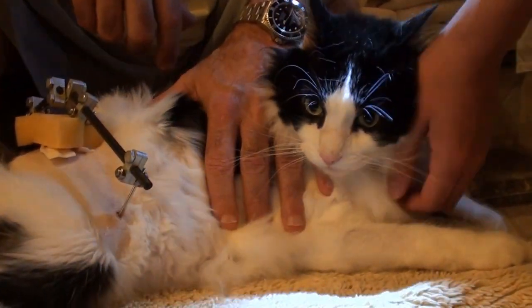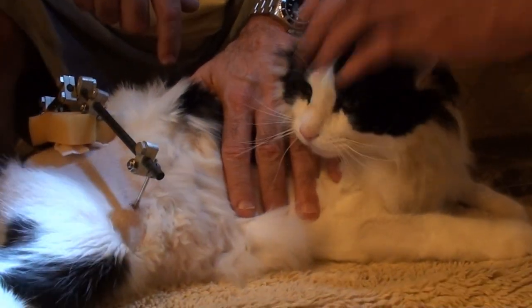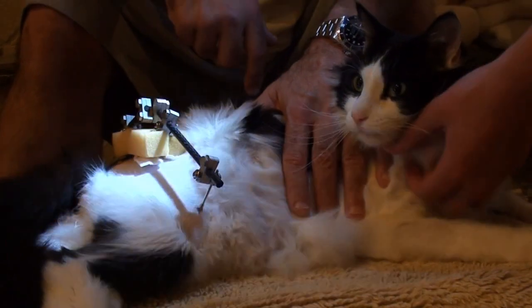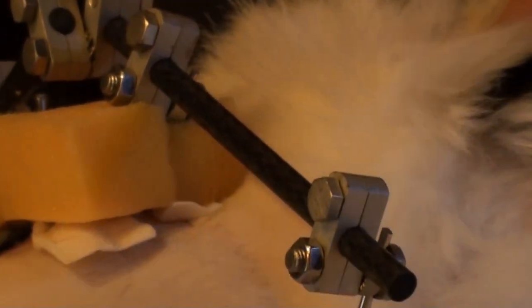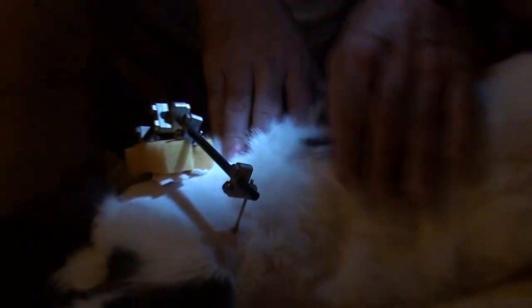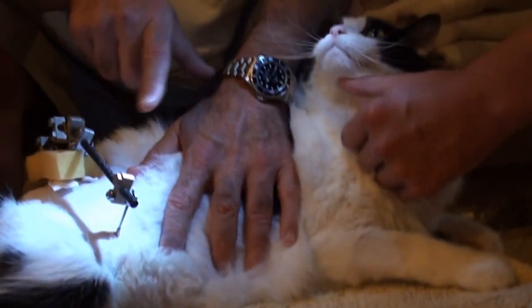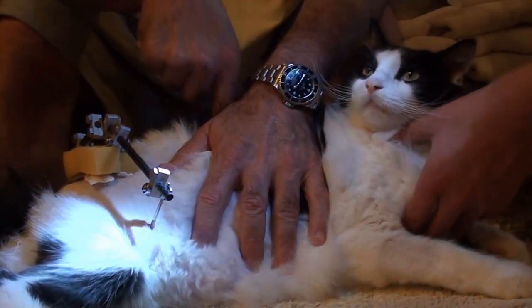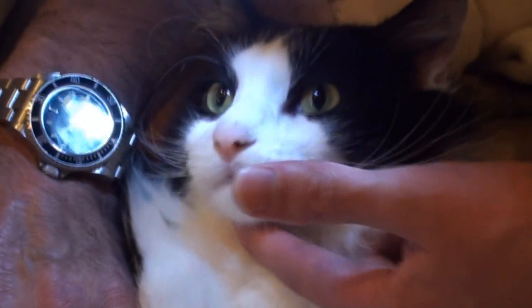Kitty has just transferred his powers over the mic. Give me some gauze. You can see this looks like a graphite shaft right here. Kitty, don't lick the flashlight. It looks nice actually — it's like the stuff like tennis rackets, you know? That's exactly what it's made out of — it's like weaved Kevlar stuff or something. Remember when I had 18 of these metal rods going through my leg? Danny keeps stepping on my foot and hurting it — trying to put rods back in my foot again.